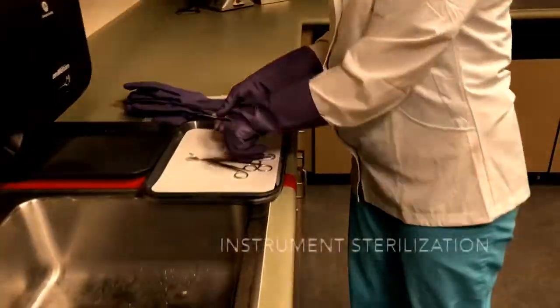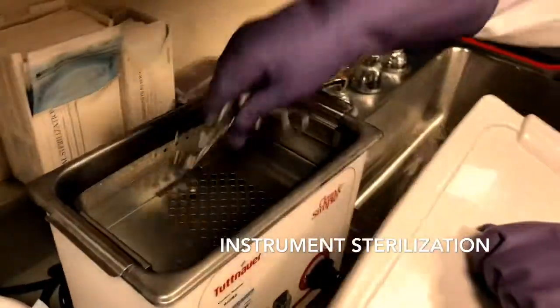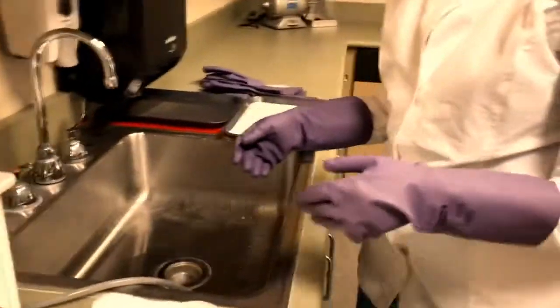Here we are preparing all of our unsterilized instruments and getting them ready for the ultrasonic cleaner. As you can see, she is wearing all of her personal protective equipment and her utility gloves. She sets a time and there she goes.